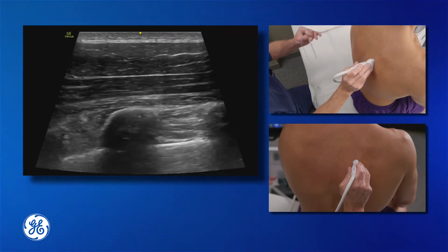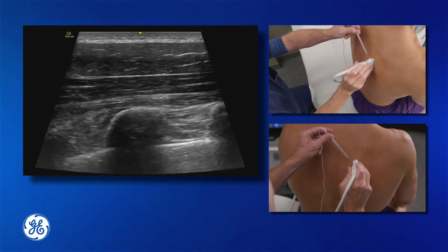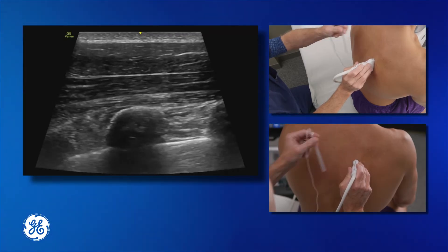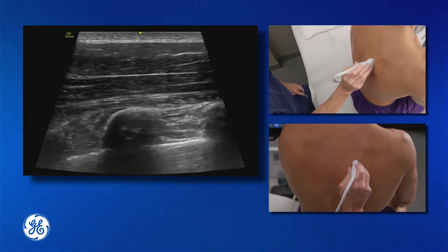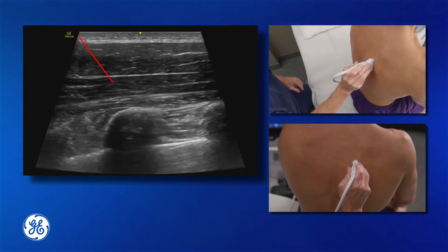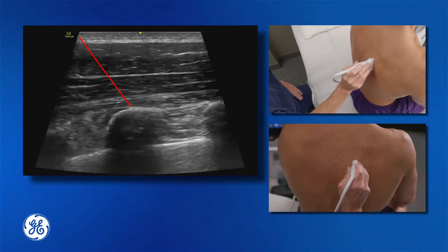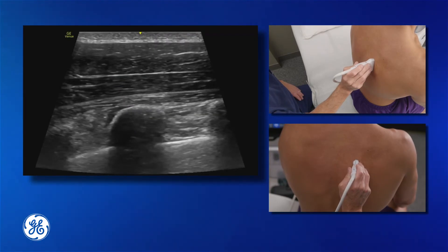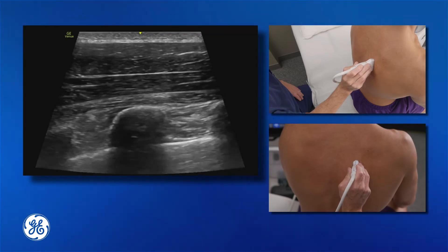Our needle entry point will be from the cephalad side of the probe. Ideally, we want to aim towards one of those transverse processes. This gives us a safety buffer so that if we advance our needle too far, we're reducing our risk of pneumothorax. We can touch the top of the transverse process, step back just a millimetre, and inject beneath that erector spinae muscle.